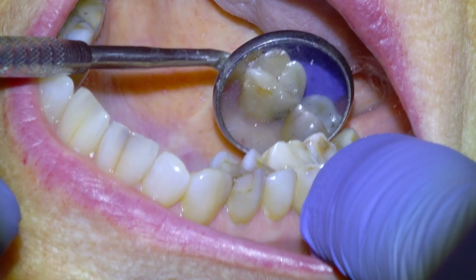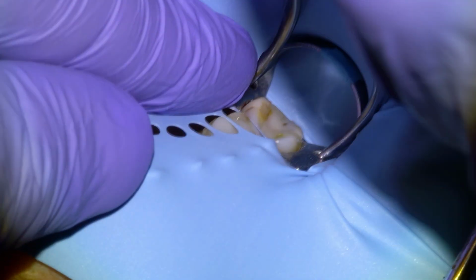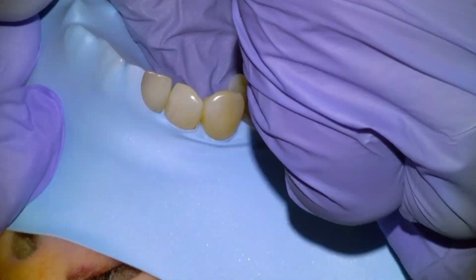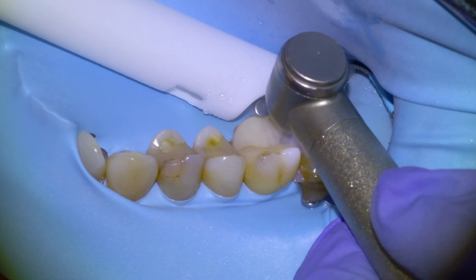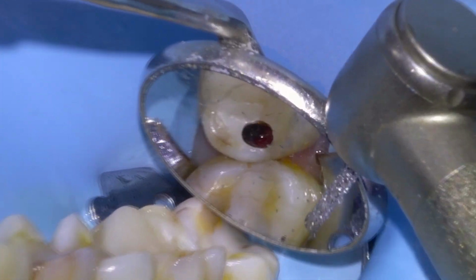So here's the tooth clinically. You can see the dark area along the gum line and the Emax onlay. We're going to start by isolating the quadrant with a rubber dam from the second molar to the midline. And once we have good isolation, we're going to start our prep with a coarse grit KS1 burr on a high-speed handpiece, accessing the lesion from the occlusal aspect, and it doesn't take us long until we punch through.